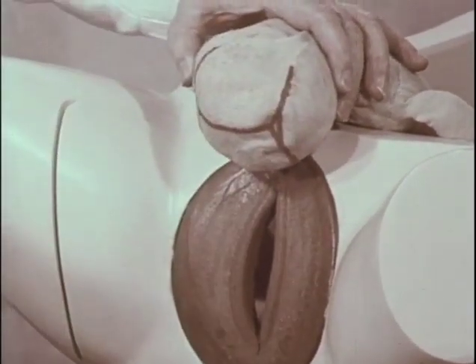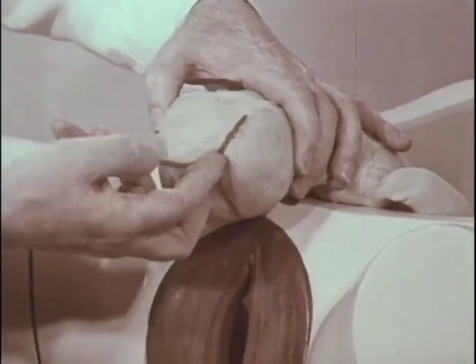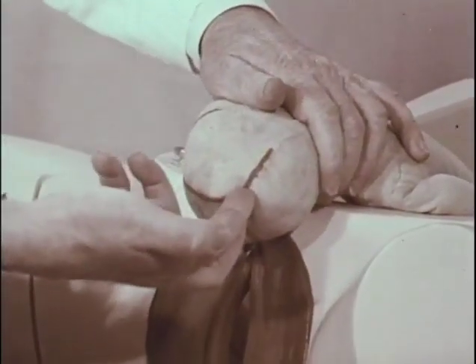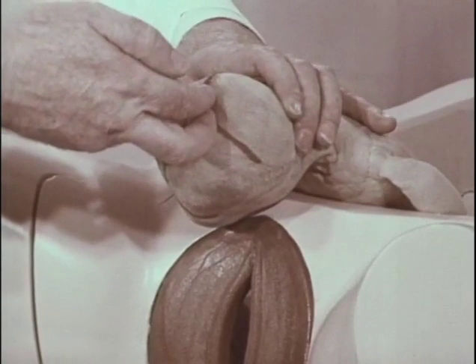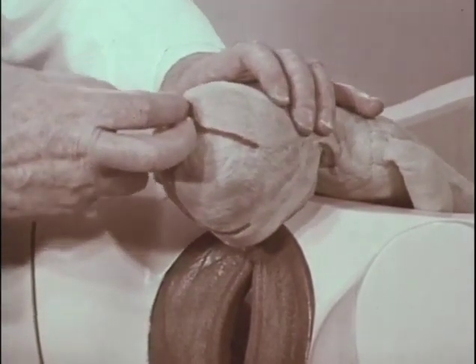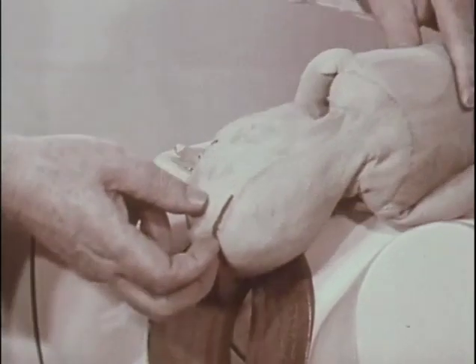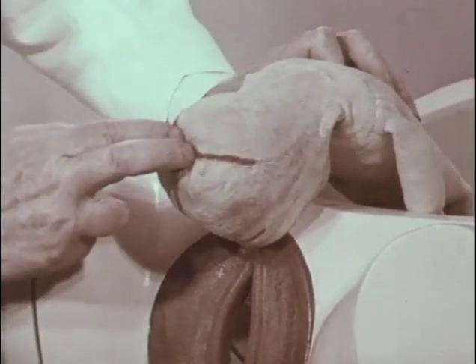In the digital maneuver, the tips of the middle and index fingers are placed at the elevated edge of the anterior parietal bone in the anterior half of the lambdoidal suture, close to the posterior fontanelle, with an elevating, hooking, rotating maneuver. The occiput is rotated around from LOT through LOA and as close to OA as possible. At the same time, the left hand on the fundus is giving counter pressure to prevent displacement and rotating the body inward to facilitate the rotation of the occiput.